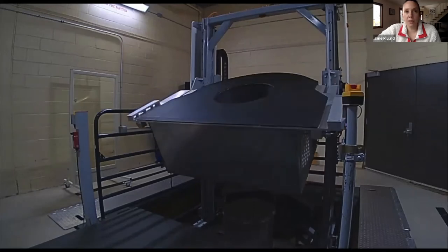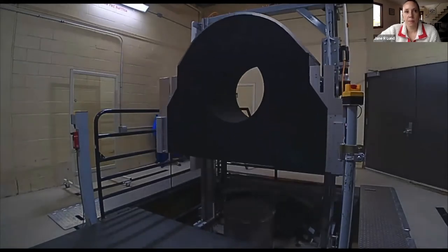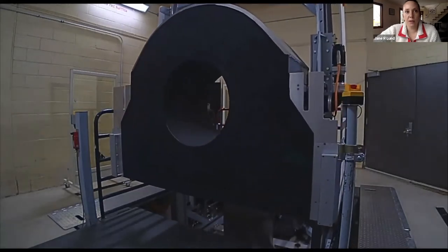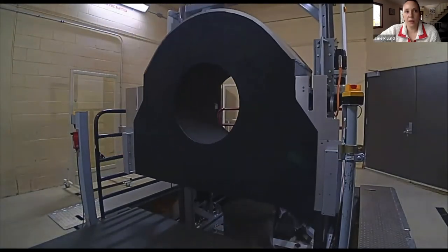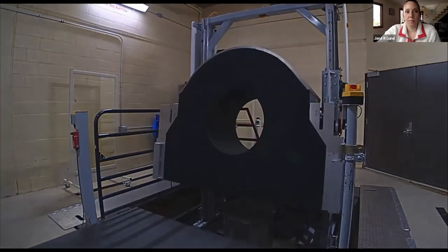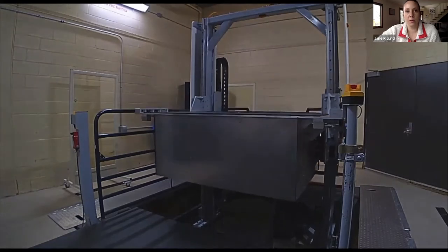And so pins on each side are removed. The gantry is rotated 90 degrees. The pins are replaced. And then the gantry can go up and down, so depending on the size of the horse, we can adjust it for that. And then this would be moving forward to position for a head scan, and then again, scanning as it moves away. And then back down into the limb mode.